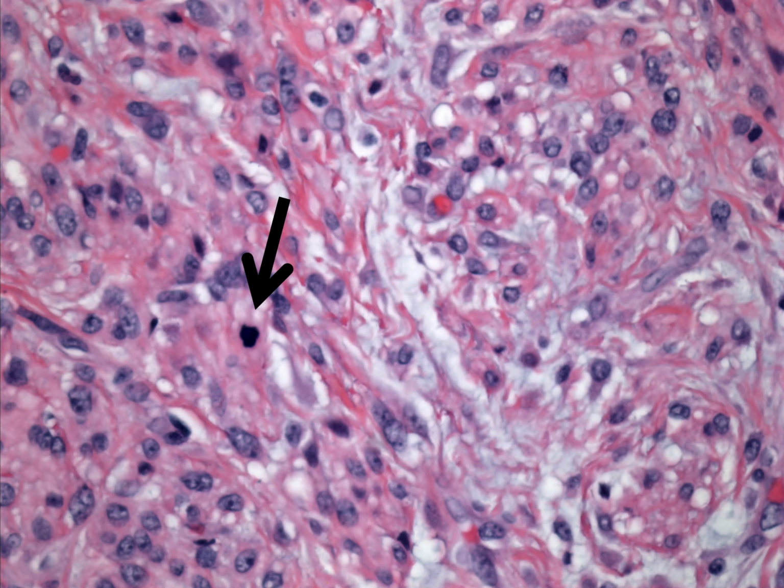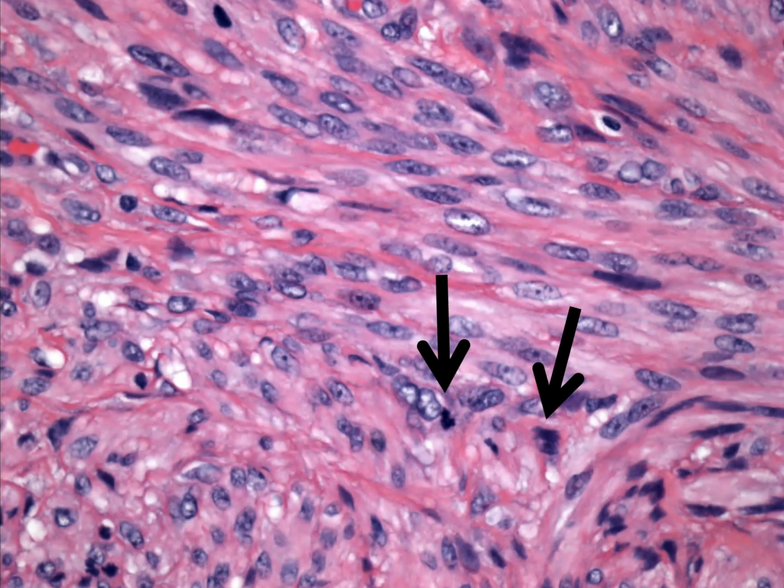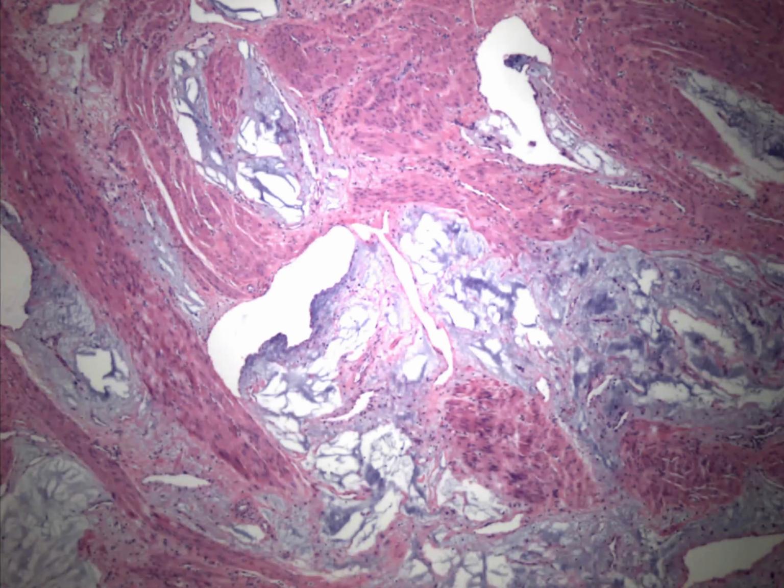So these don't photograph extremely well, but I will promise you that that's an actual mitotic figure. And then in other areas, you start to see two, and maybe even that one in between is another mitotic figure. So up to, actually, there's one at the top left-hand corner too, possibly. Although, like I said, these aren't photographing well. And sometimes you can get pycnotic material that looks a lot like a mitotic figure. It's really best to do with your microscope and a glass slide.